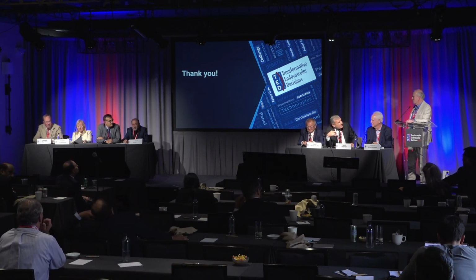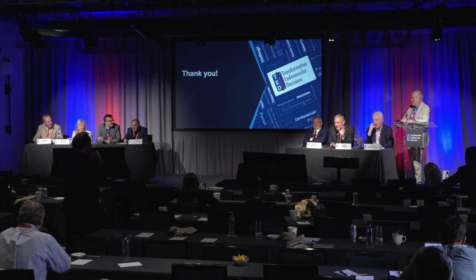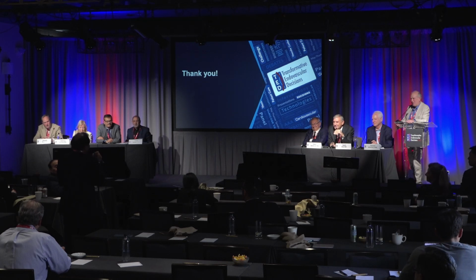Okay. Does Dr. Amaya have part of this company? You don't need to disclose it. What is interesting is always the concept of the technology, and that's what attracts me to technology, the concept. And this is out-of-the-box thinking. Basically, you're not putting anything into the artery. You're using Prolene, and there's no plug, there's no nothing, and it's very unlikely that you'll actually damage the artery. But if you can get complete hemostasis, it's a game changer.